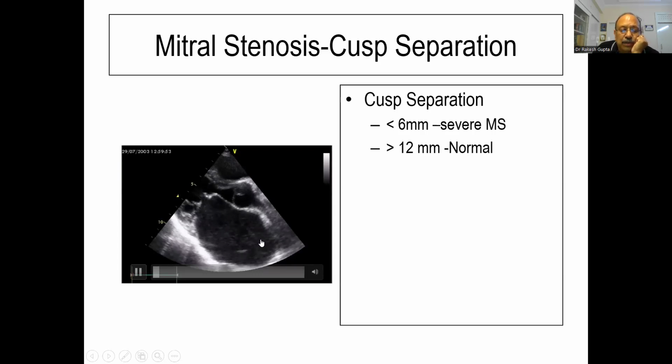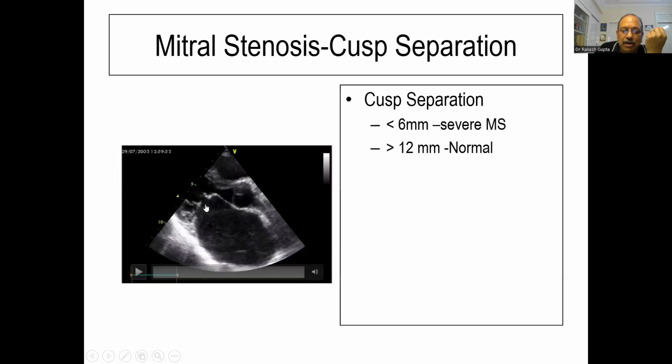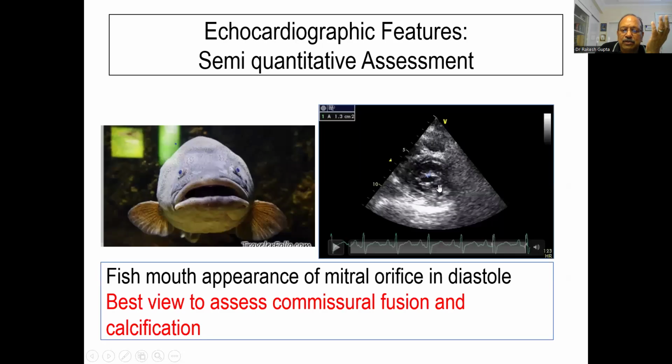Now get to the Drop score. We have LA thrombus out. Look at the LA appendage thrombus out. Third, the amount of regurgitation, severe regurgitation out, moderate plus regurgitation out. And then finally, I'll go to short axis view to look for commissural calcification. Look, there is no commissural calcification over there. This is the lateral commissure. This is the medial commissure. There's only a speck of calcium over here. The majority of the time this is fibrosis. So as far as commissural calcification is concerned, I'll say 1 by 4.